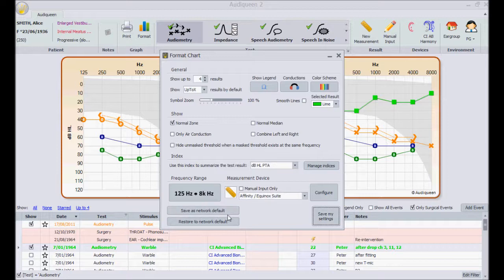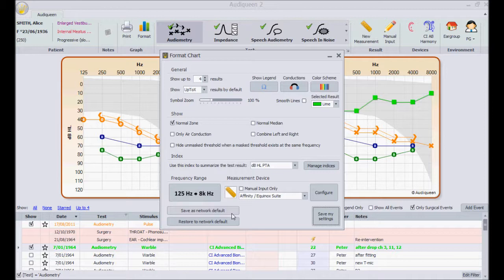If I have administrator rights, I can also save these format options here. Now they become the default settings for all Audi Queen users in my network.